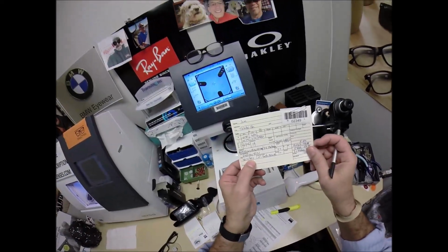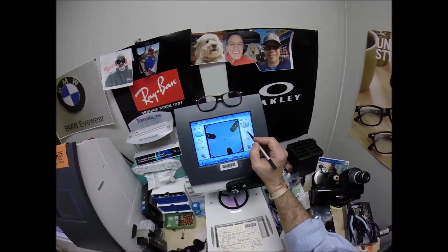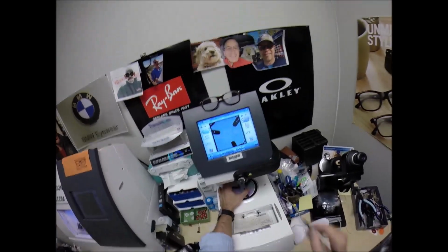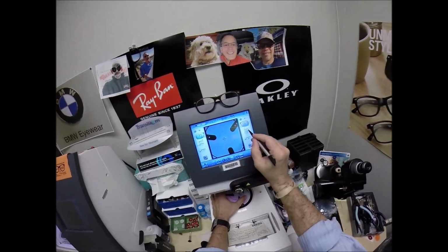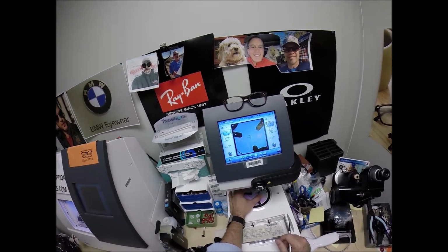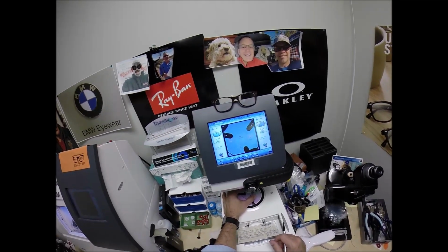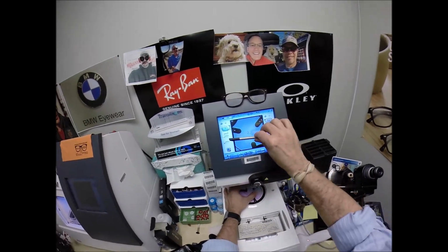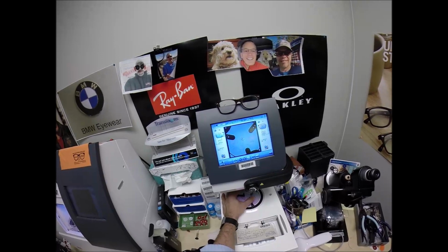Now, your pupillary distance, 33.5 for the left. It has mirrored the right, 32.5 and 19. So I'm going to tap the plus button a couple times till we get up to 33.5. Use the layout of the progressive, get everything lined in there perfectly. That's going to sit directly in front of your pupil. These other two tells me that it's oriented in there just perfectly.